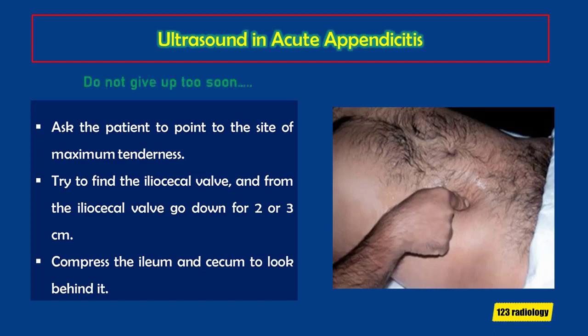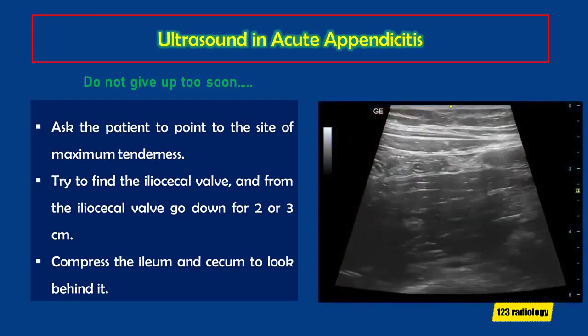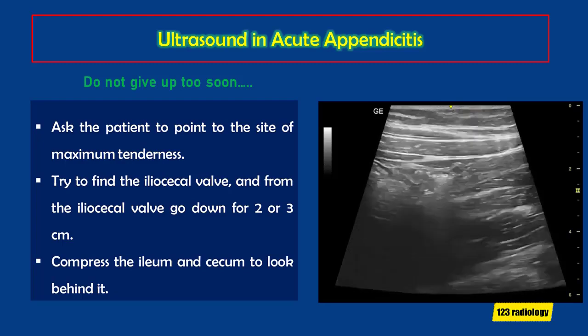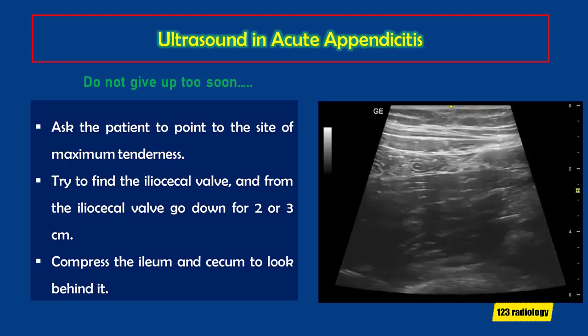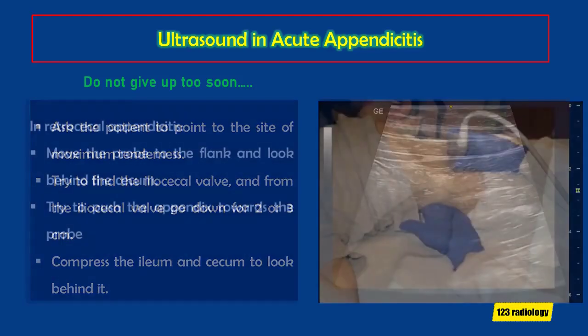Don't give up too soon, search where the pain is indicated and also search systematically. Try to find the ileocecal valve, and from the ileocecal valve go down for 2 or 3 centimeters, and usually that is the location of the appendix. Compress the ileum and cecum to look behind it.